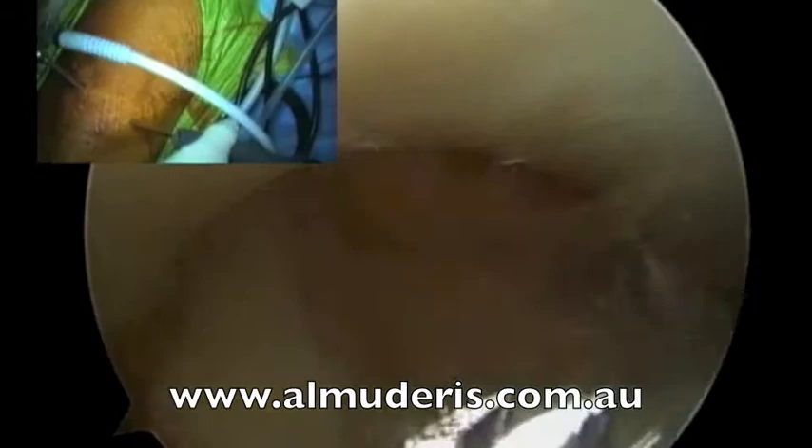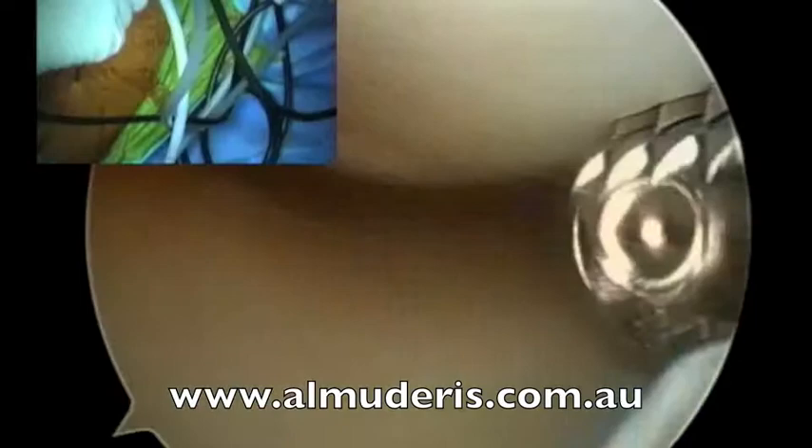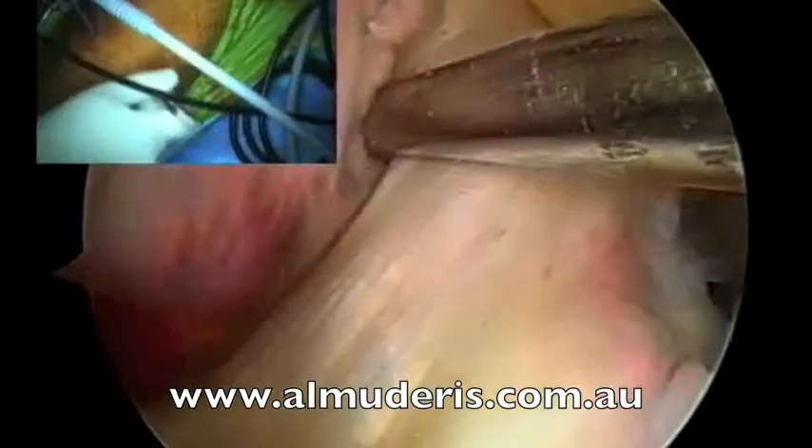You can see there is a loose body. We go through the medial portal and inspect the medial joint. Using the shaver, I clear some of the fat pad as we go into the medial joint. Give me valgus please. We clear the loose bodies, which is usually a fibrinous clot. The medial meniscus seems to be intact.